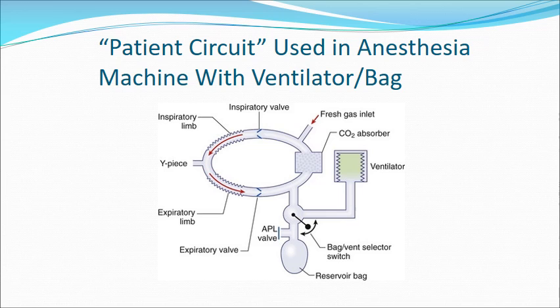It forces the direction of the breathing. And one of the differences in anesthesia with the patient circuit is it's a closed system where you're trying to recapture anesthesia gas and filter out carbon dioxide. So it's quite different than long-term ventilation for respiratory therapy needs.